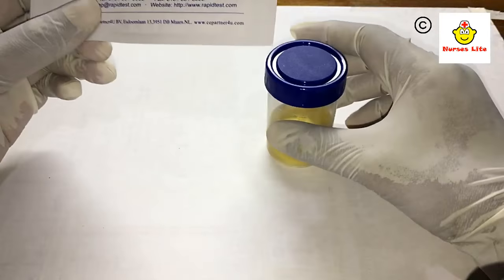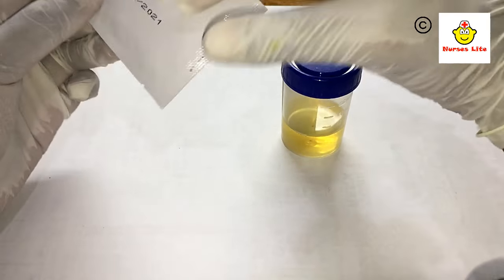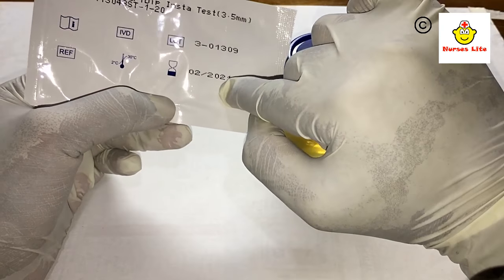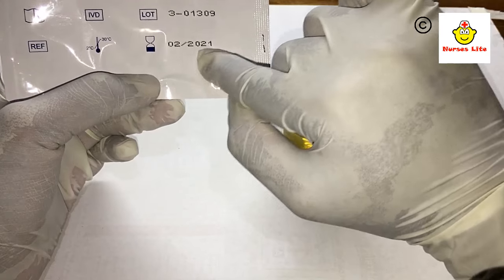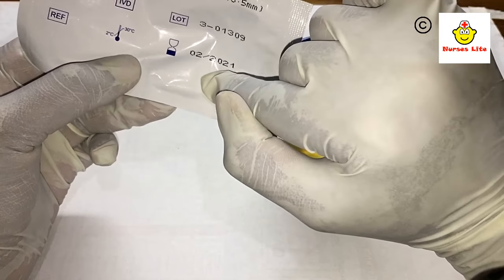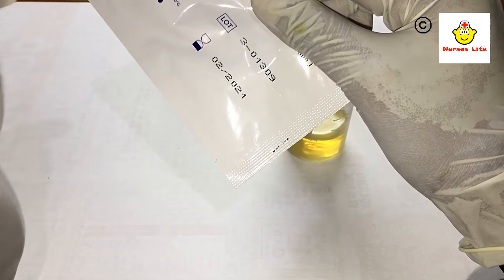Before performing the test, we should consider the expiry date. You can see this is the expiry date on the strip — it is somewhat near to the recent date. You must always check the expiry date first, because if the strip has expired it will give a false result.